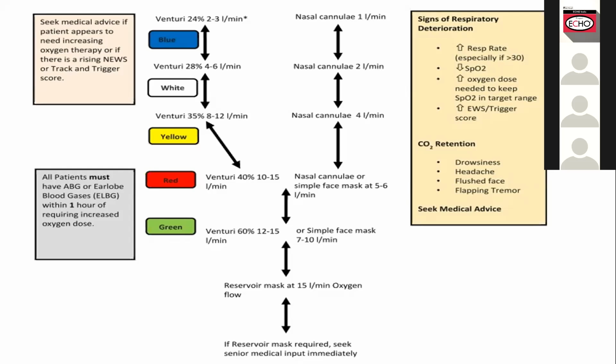And with the Venturi face mask, you can go up to a 15 liters per minute flow rate. And with that flow rate, your inspired FiO2 is around 40%. And here we have signs we can base on to see if your patient is not doing well on any of the devices you are using to deliver oxygen.